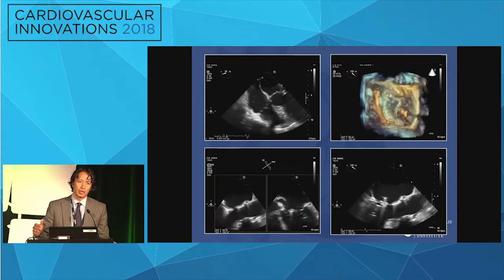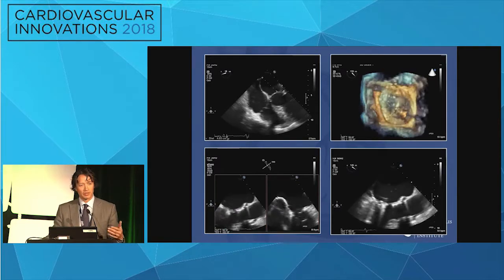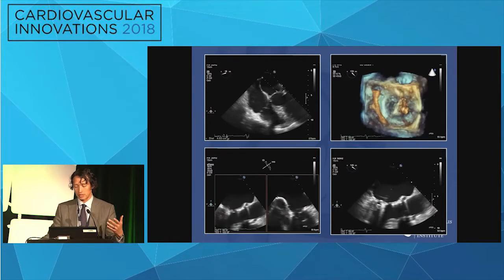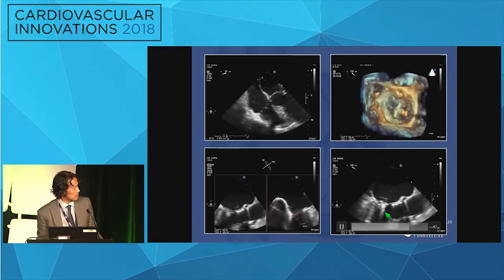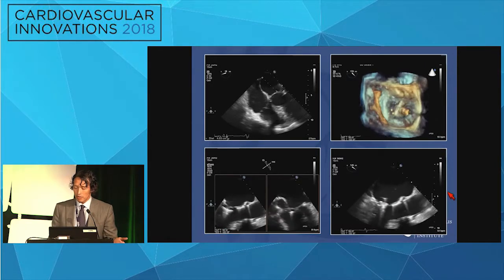And at this point, my thinking was, well, where do I want the papillary muscle to end up? Because this is ruptured. It's flailing into the left atrium, flopping back and forth between left atrium and left ventricle. And I'm thinking to myself, well, nature wanted the papillary muscles in the LV. So we kind of timed it to where you can see in the bottom right-hand side, if you look very closely, the papillary muscle is trapped on the LV side. And so I think we got what we wanted, and it looks like it's better.